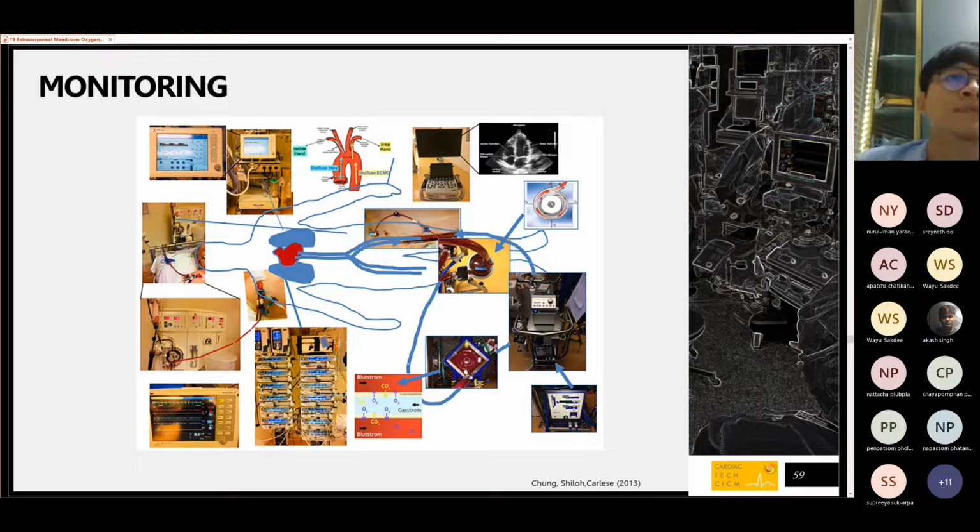That is the concept. Another thing, you can see the drug support, many drug supports, and the wide line here is the same. This patient also has hemodialysis to maintain the renal function also. Ventilator also supports here. You see, the ventilator is still supporting here.